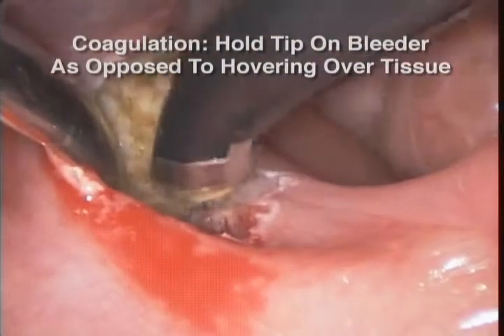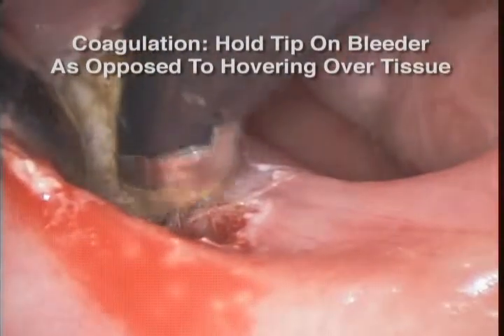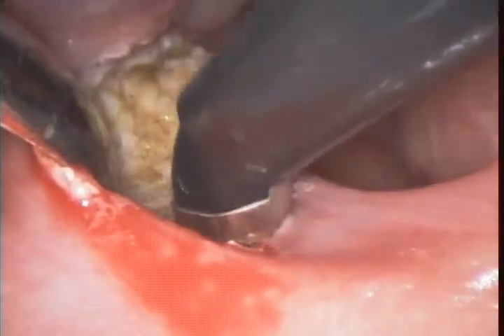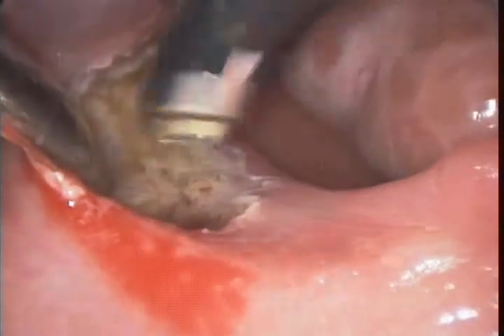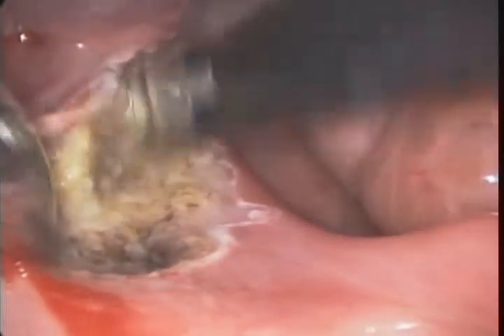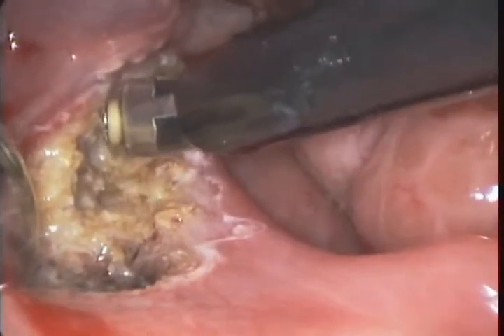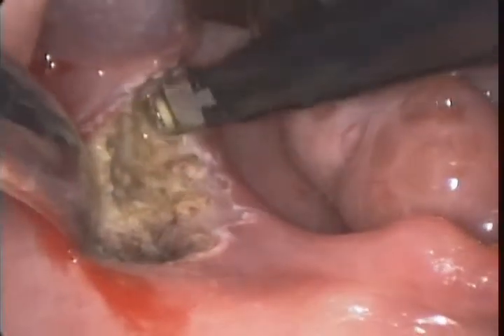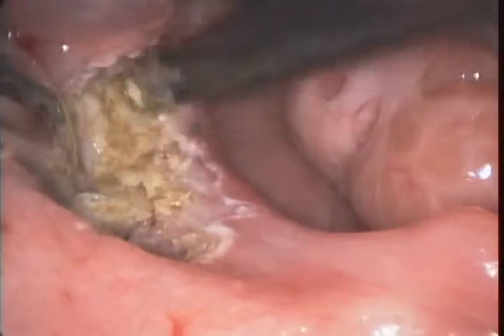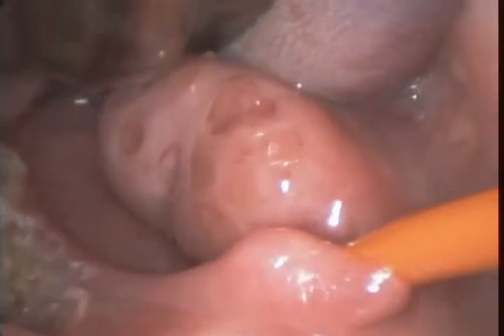Now with coagulation, the tip is actually applied to the surface that you're trying to coagulate, and you're actually in contact with the tissue as opposed to hovering over the tissue. And what we're trying to achieve here is removal of 95 to 98% of the tonsil bulk, leaving the thinnest portion of tonsil over the capsule to protect the capsule from being penetrated. So we're going to move to the other side right now.